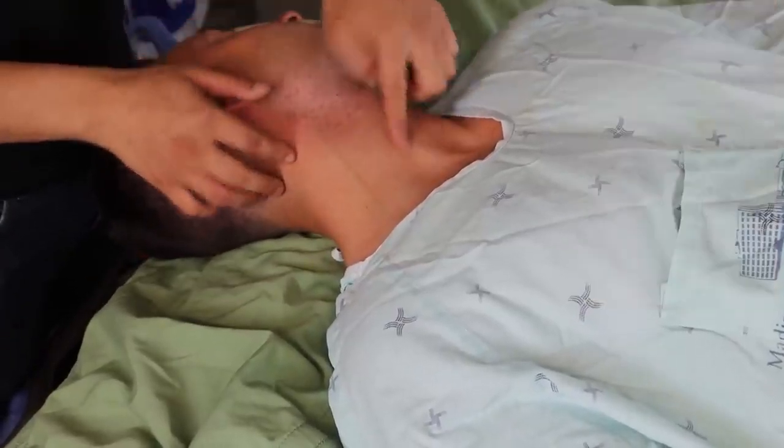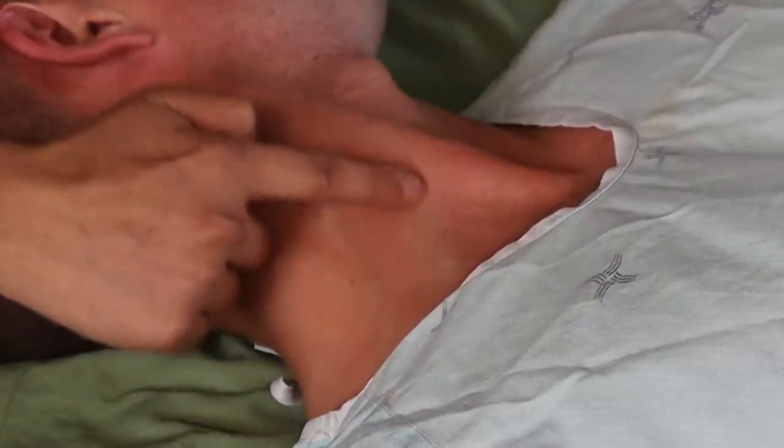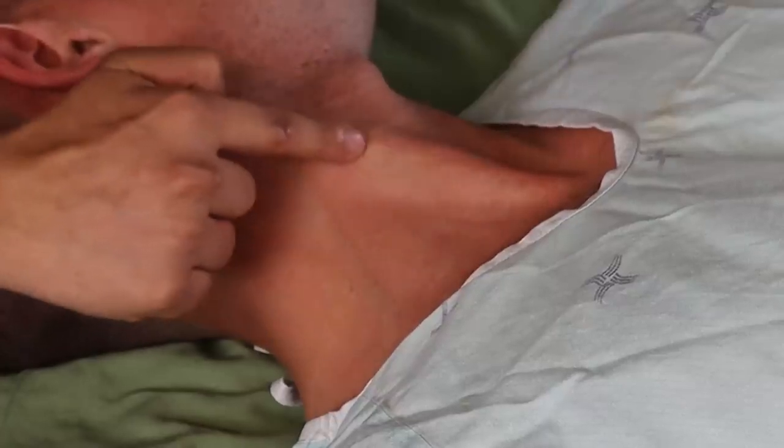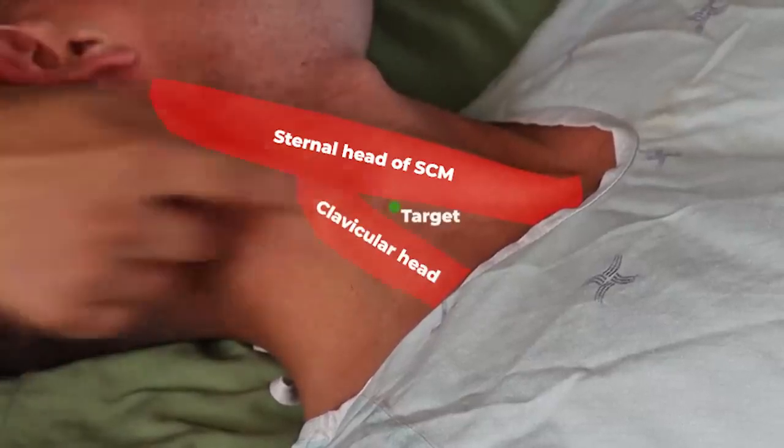Let's have a look at some landmarks. We'll do the line with ultrasound that is absolutely the standard of care and what you should be doing. But in the old days, people used the two heads of the sternocleidomastoid, the sternal head and the clavicular head, which form a triangle whose apex marks the vein.